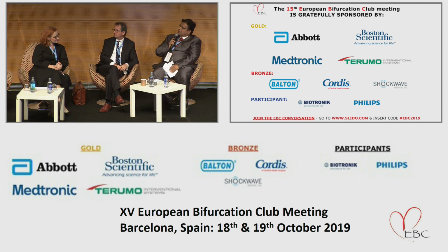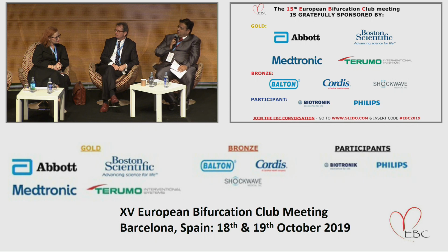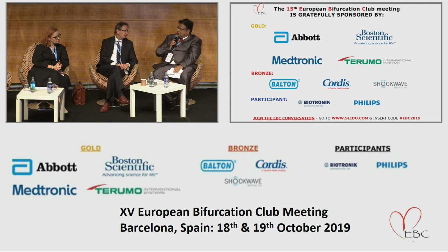I'm coming from the city where Magic Touch is manufactured. And I'm using this in phase 3 and phase 4 trials, and there are small trials we are doing in my institute. Now, we know that in ESC guidelines, in-stent restenosis is an excellent indication for any drug-eluting balloon.